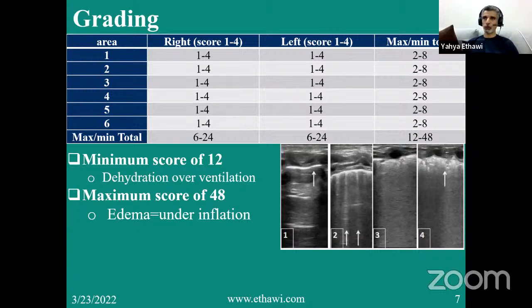So you do not go and do ultrasound for a baby who's breathing normally, unless you want to show people what is normal lung. But usually we do not do ultrasound just for fun on a normal lung, and very rarely you'll get a normal lung. You always do the lung ultrasound for a reason. So you can say there is no abnormal finding. You can say the score is this. And you can say that. We will show you how to report.